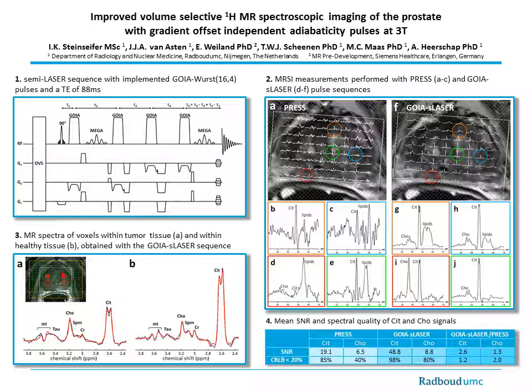Water and lipid signals are suppressed using MEGA pulses and outer volume suppression bands. The interpulse delays were optimized to maximize the amplitude of the inner doublet of citrate and to minimize the side lobes. This increases the signal-to-noise ratio of citrate and minimizes the overlap of the outer resonances with neighboring resonances.